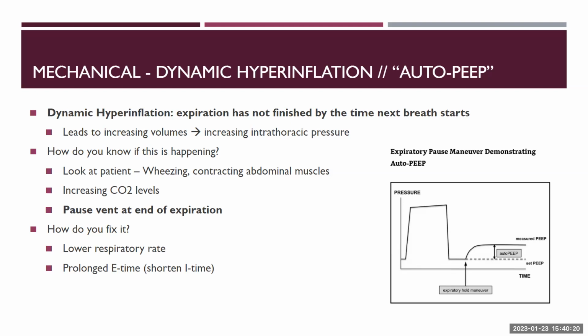They would go dysynchronous with the vent and frequently either try to squeeze their chest and create essentially a force against the inspiration, or will bite the tube and prevent the exhalation from happening. Some ventilators are very smart and can adjust for that, but if the ventilator doesn't pick that up, that can also lead to auto-PEEP.